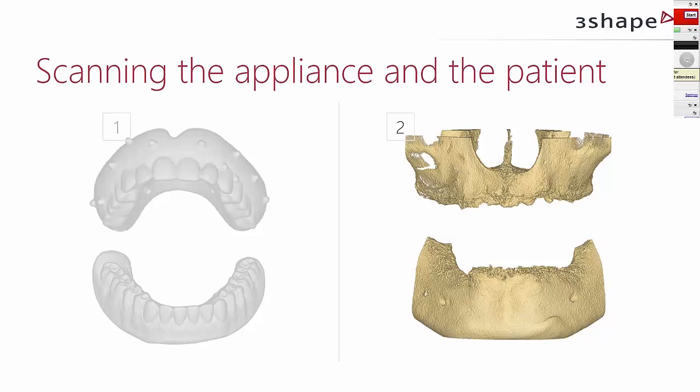You place the denture in the mouth of the patient using the bite index. You scan the patient as normal. Take a full volume scan. It depends on what the full volume scan is on your CBCT, typically around 15 or 16 centimeters multiplied by 10 or 8, in that range. And then we have all the data we need to move on to the practical part of using this data in Implant Studio software. We're going to talk about this next week.